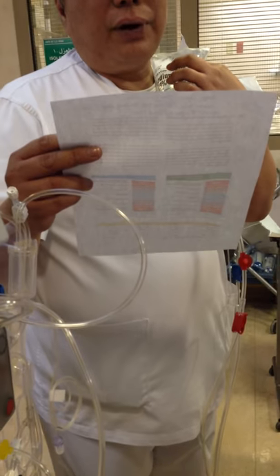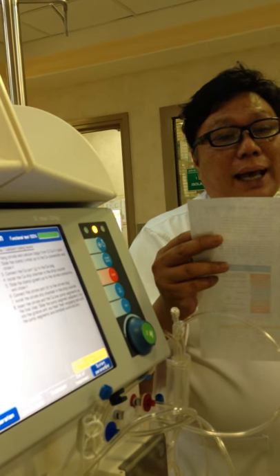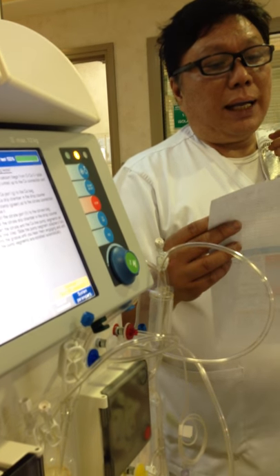When the citrate forms, it chelates the complexes. The plus, minus, and all that is a little bit too complicated. You mean the compound with the ionized calcium contained in the blood? The blood contains calcium, correct? Correct.